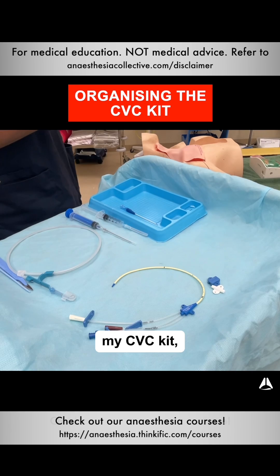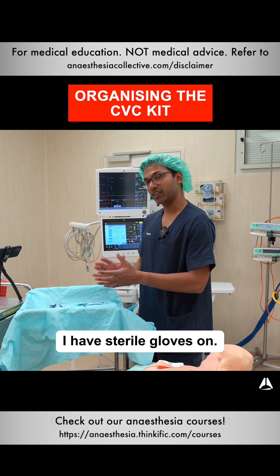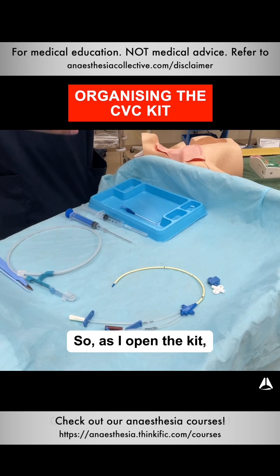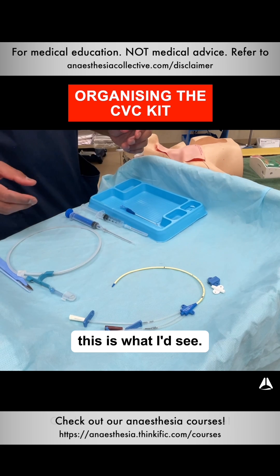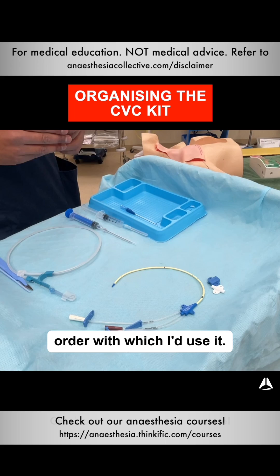When I first open my CVC kit, this is pretty much what I see. Obviously, I have a full surgical scrub on and gloves on, but just for purposes of demonstration I'll use my hands. As I open the kit, this is what I'll see — and the first thing I do is line up everything in the order with which I'd use it.